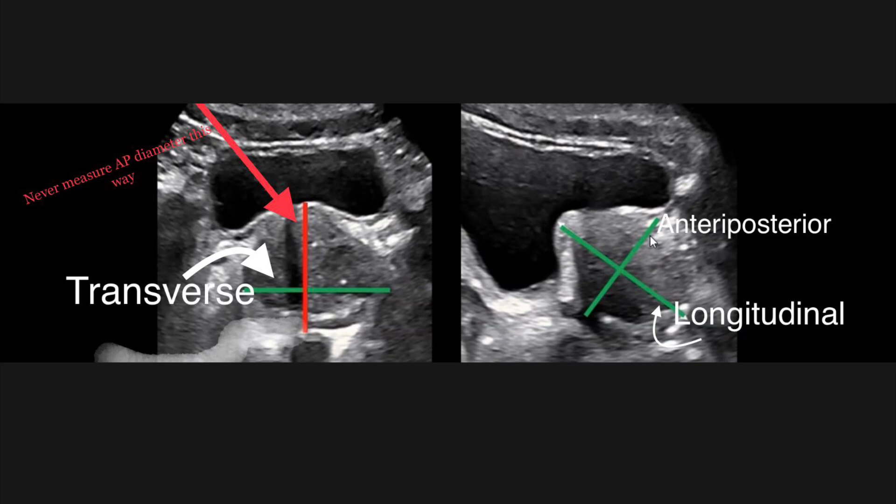For measuring the prostatic volume on ultrasound, first obtain the transverse view of the prostate, and then rotate the probe clockwise to obtain the longitudinal view of the prostate. Here is the transverse view in the first image and the longitudinal view of the prostate in the second image.